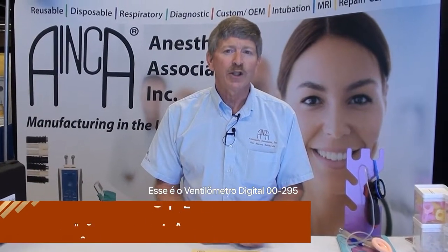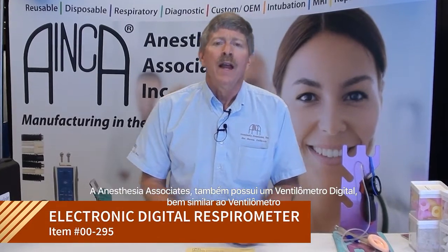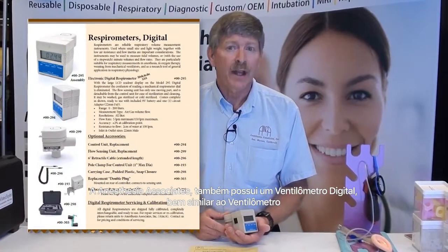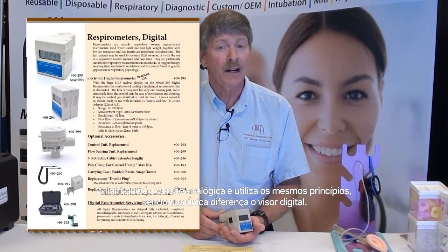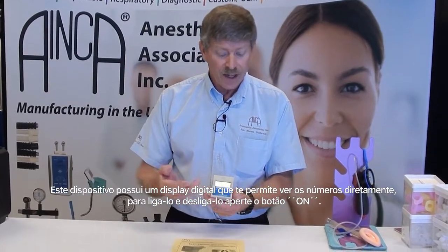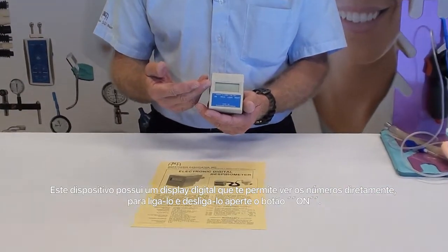This is the Anesthesia Associates 00-295 digital respirometer. It is very similar to the Wright respirometer, which is analog, using the exact same principles, but this is a digital version. The device has a digital readout in the front that will allow you to see the numbers directly.